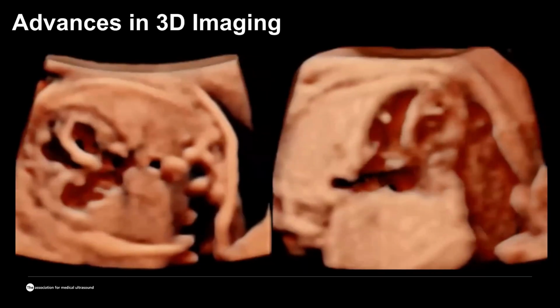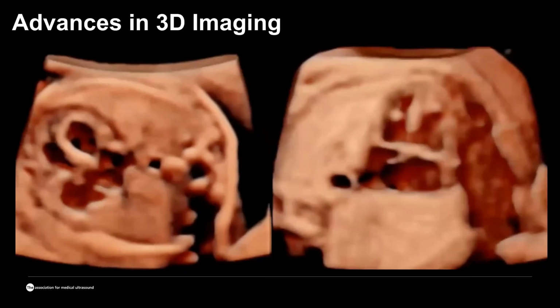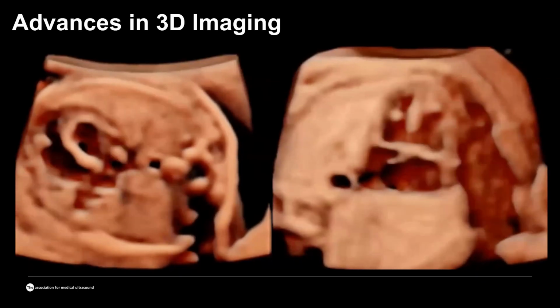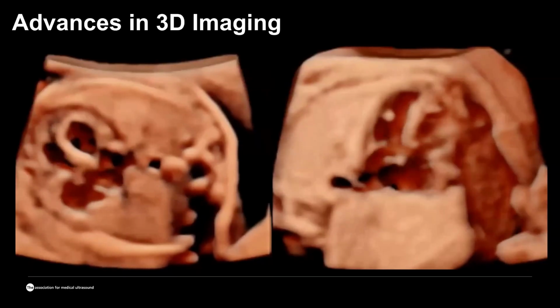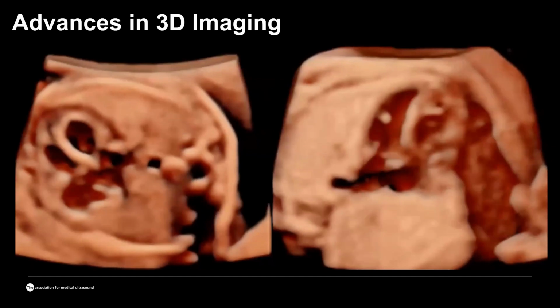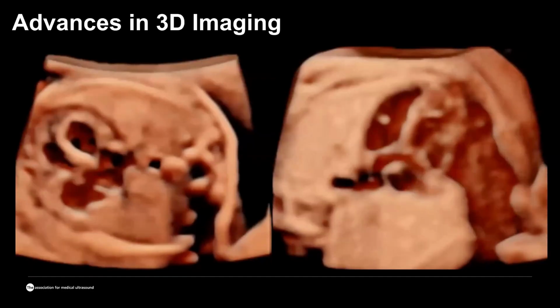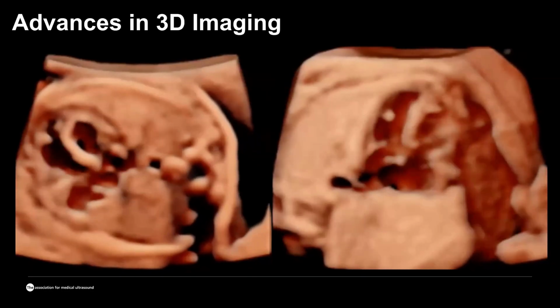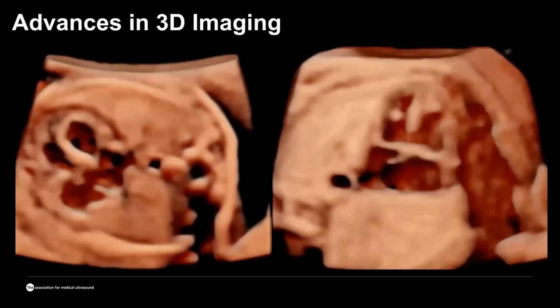Of course, I would like to mention very briefly that advances include 3D imaging. Those technologies got faster. Again, this is traditionally something that is reserved for experts, now available for novice operators, because it's much easier to manipulate those volumes, and a lot of the tedious, difficult and time-consuming work is taken by the artificial intelligence, and it takes really seconds to get images like that.